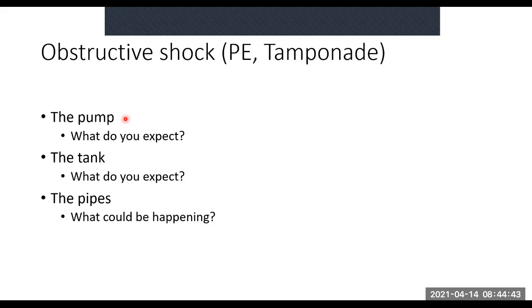Okay. So we discussed something called McConnell's sign, which is where you have a dilated heart with just a contracting apex because it hasn't had a chance to actually compensate. As compared to somebody who's got COPD, where they've had a long time, you'd expect a hypertrophic heart, right? That's also enlarged and things like that.